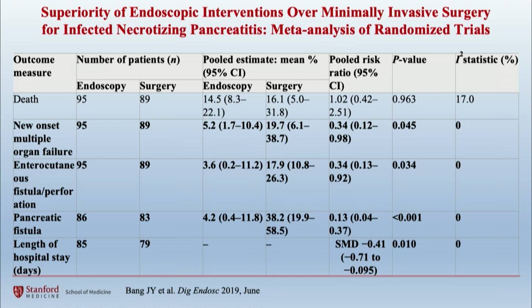We have multiple studies and randomized controlled trials that have shown that using EUS intervention in drainage of pancreatic pseudocysts is more effective than even minimally invasive surgery. There are also many trials that have shown that EUS intervention in walled-off pancreatic necrosis is superior to minimally invasive surgery with respect to outcomes.